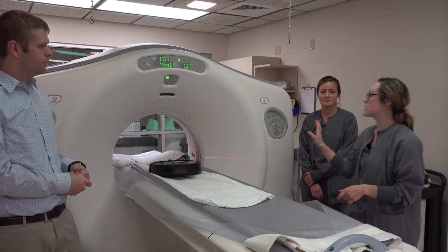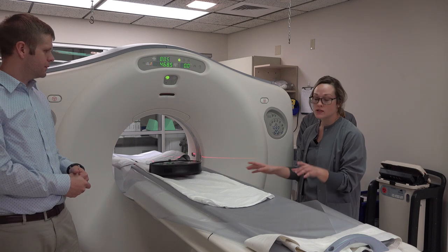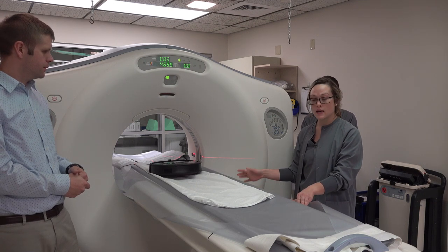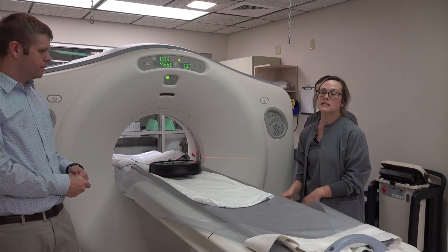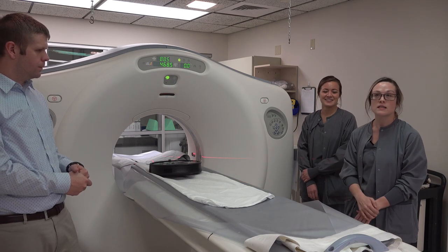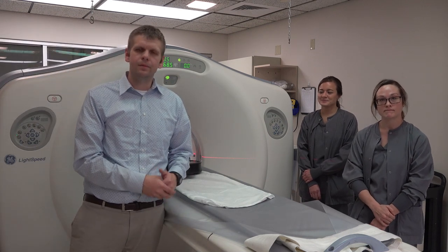She's our resident CT expert, and she's going to tell us a little bit more about what we're looking at. Okay, so as you can see, this is our CT camera. It goes all the way around to get that 3D image. This is the bed that our patient lies on. It can go back and forth, so we get our patient centered where we need to be. The CT scan takes about 35 to 40 seconds, and it just gives us a better detail than what x-ray would. Great. All right, let's scan some Roombas.